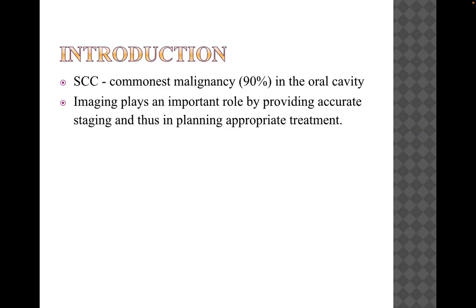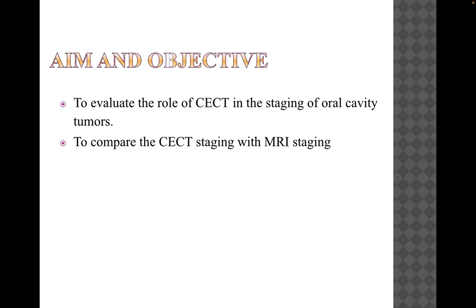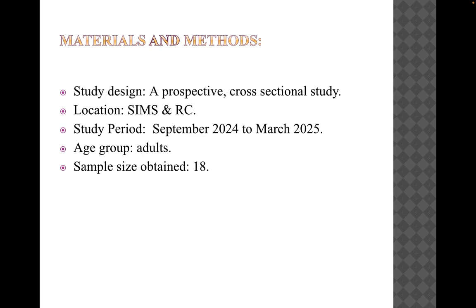Introduction. Squamous cell carcinoma is the commonest malignancy in the oral cavity. Imaging plays an important role by providing accurate staging and thus planning for appropriate treatment. Aims and objectives: to evaluate the role of CECT in staging of oral cavity tumors, and to compare CECT staging with MRI staging.